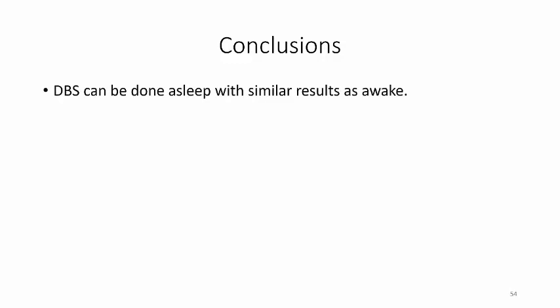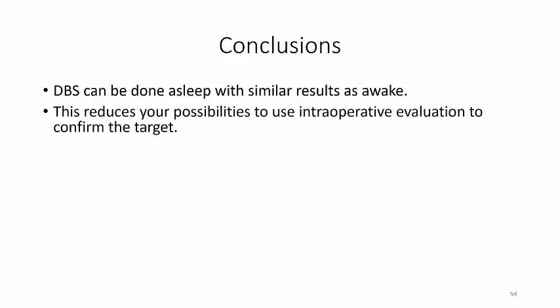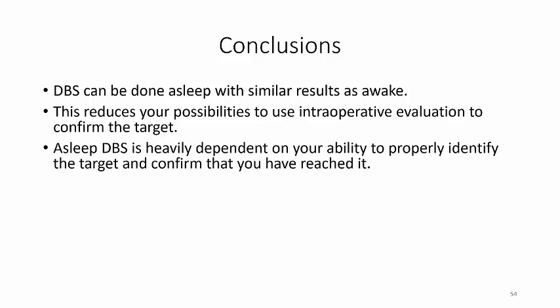So, in conclusion, DBS can be done asleep with similar results as awake. This reduces your possibilities to use intraoperative evaluation to confirm the target. Asleep DBS is heavily dependent on your ability to properly identify the target and confirm that you have reached it.